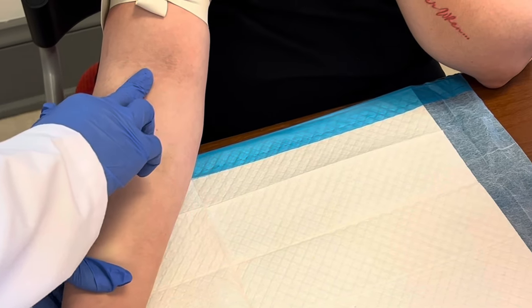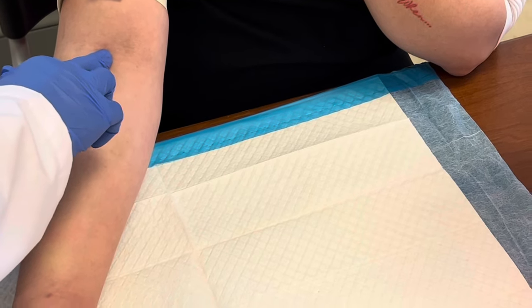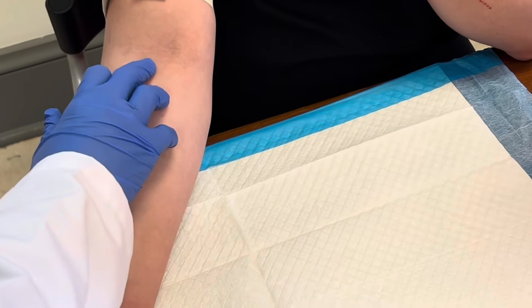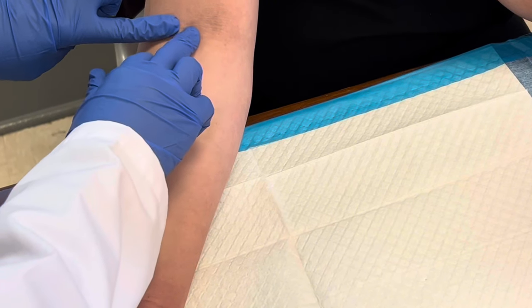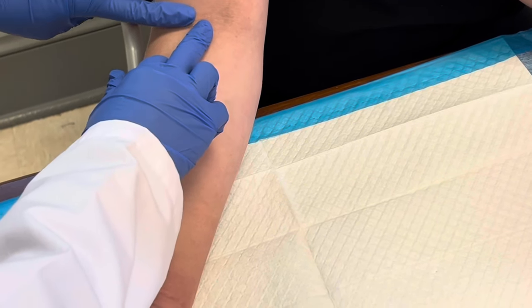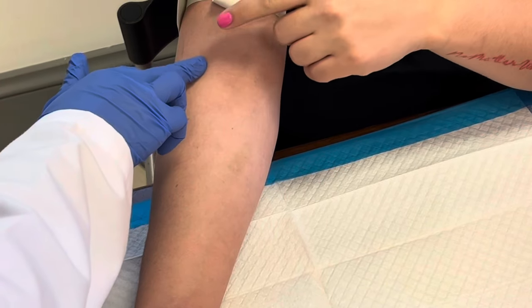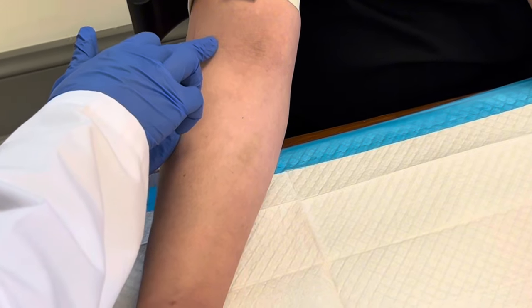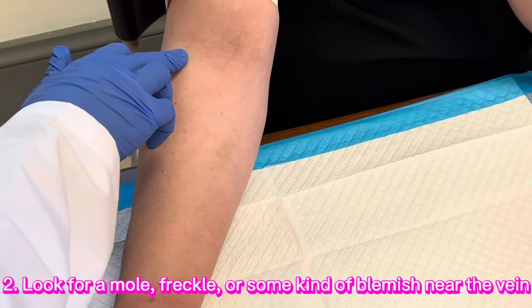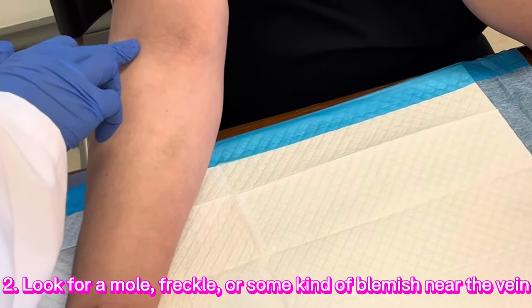I feel her vein, but the problem is that I can't see it. So I'm going to tell you guys something that always works for me. What I do is I feel the vein and I try to find some kind of mark or blemish on my patient's arm so I know where I'm going. She also has one here — actually, her cephalic vein is right here too, and I actually like this one better.